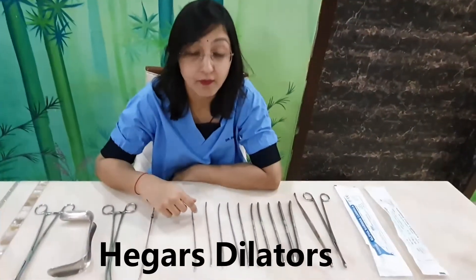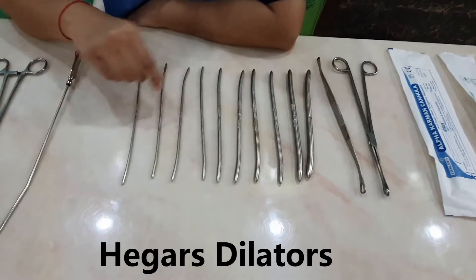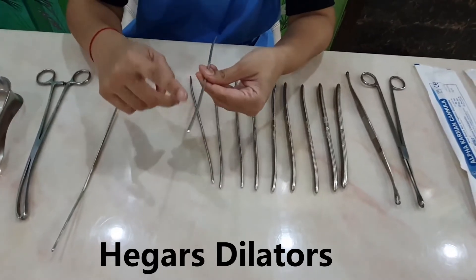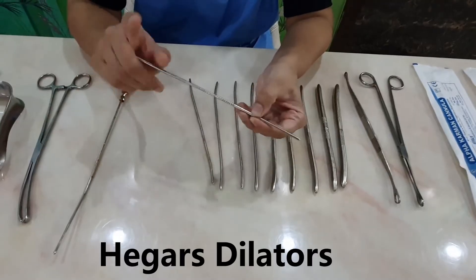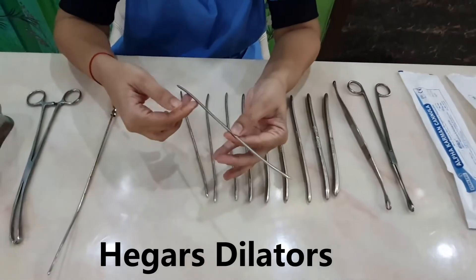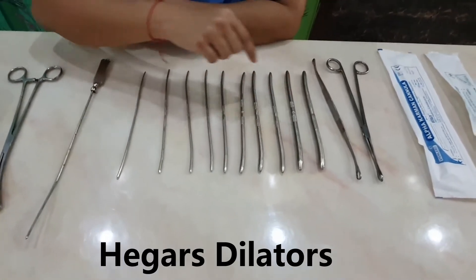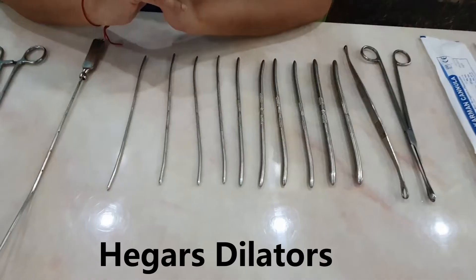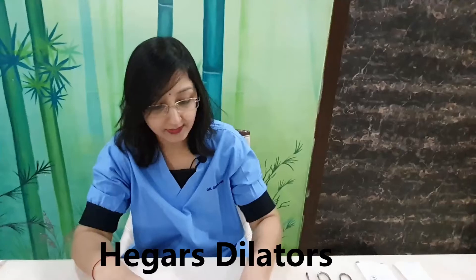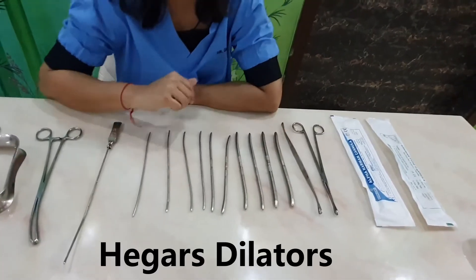Now coming to the dilators — this is a set of Hegar dilators. There are dilators of increasing size, numbered from 1 to 11 millimeters. Each dilator has two ends, both acting as dilators: one smaller and one bigger. The numbering written on each tells the diameter. We introduce the thinnest one first and gradually use increasing sizes to dilate the internal os so that subsequent instruments can enter the uterine cavity.